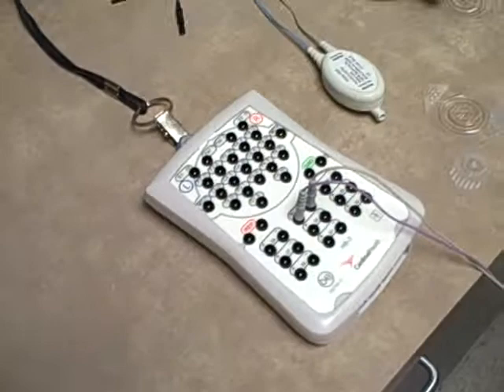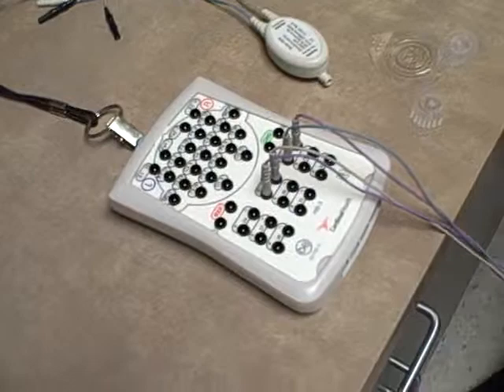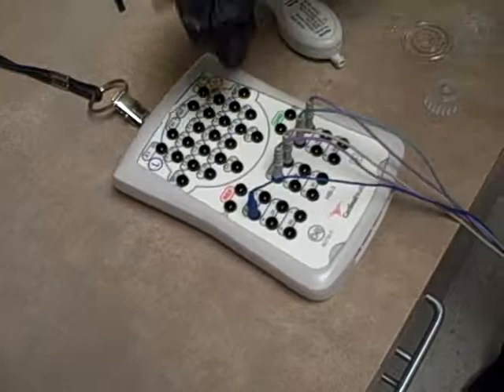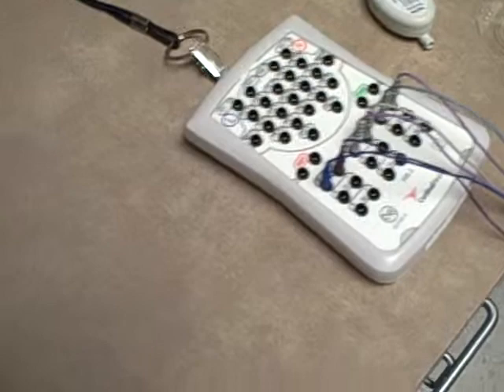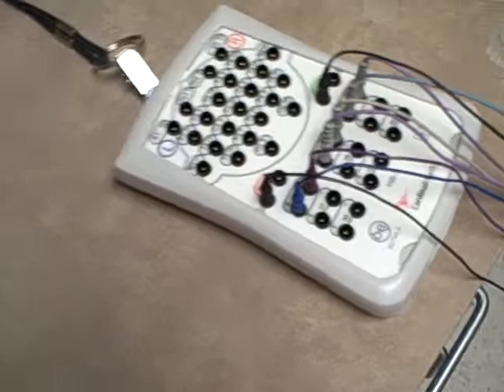These are our left leg leads, and these are our right leg leads. This is EKG1 that went under the left arm, and EKG2 that went on the right chest wall. These are our referencing grounds — the two stickers we put on the forehead. One goes in reference and one goes in ground.